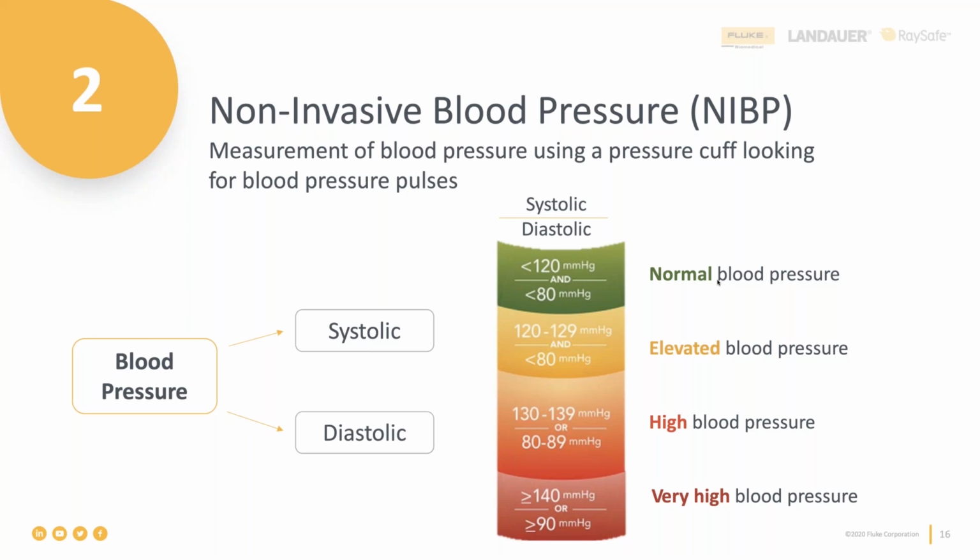And setting alarms is actually critical because it is necessary for the staff to check if the patient is exhibiting either hypertension that we were just talking about or hypotension. Since those are two extremes, it is critical that the hospital staff can promptly react to an indication of one of those conditions happening in the patient.